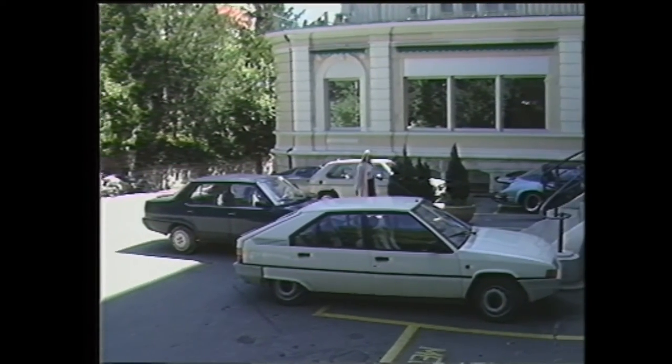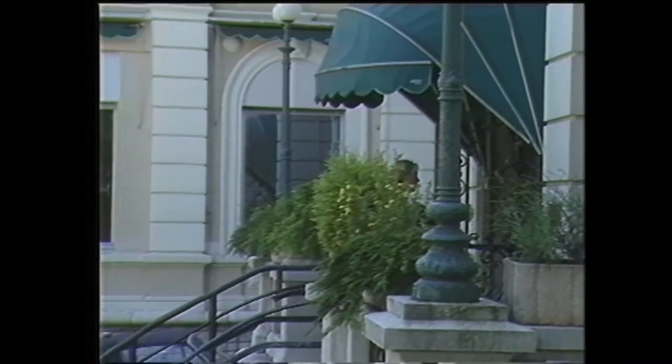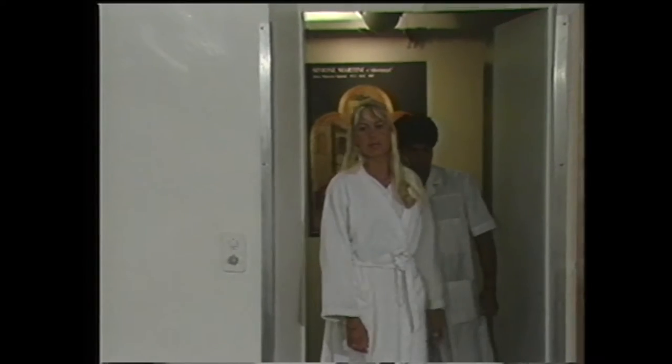Enfin, ce lithotriteur dont le prix d'achat est bien inférieur aux autres lithotriteurs ne nécessite l'utilisation d'aucun consommable tel qu'électrode ou générateur, raison pour laquelle le prix de revient du traitement est de deux à trois fois inférieur au prix de revient des traitements avec les anciennes générations de lithotriteurs.